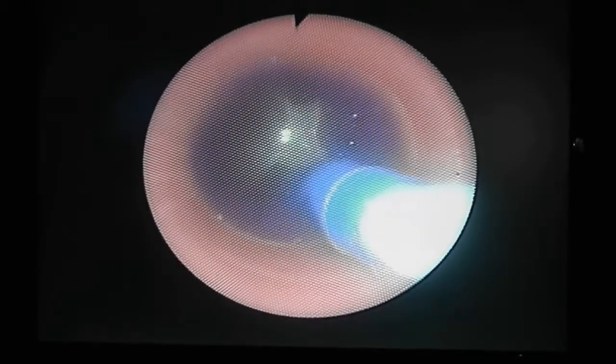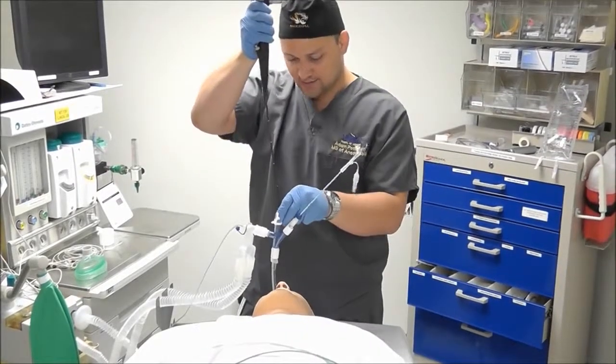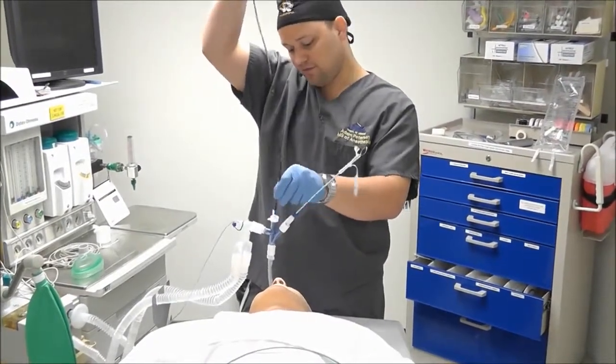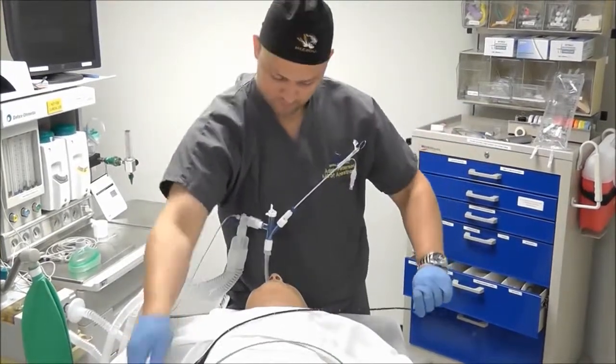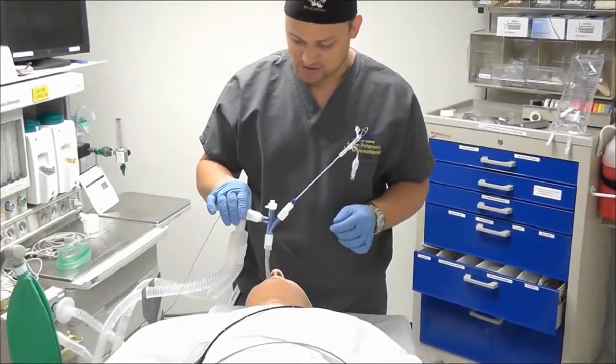thereby isolating the lung. After you've inflated the cuff and isolated the lung, go ahead and remove your scope, making sure to close the gasket, that way you maintain positive pressure.